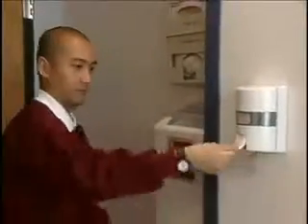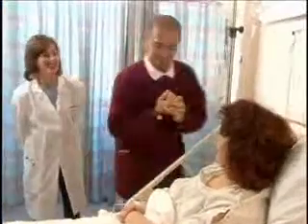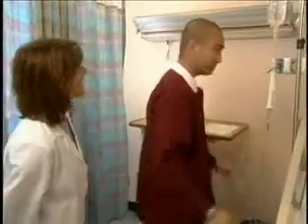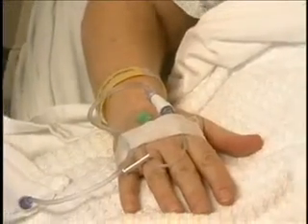So you feeling a bit better? I am doing quite well, really. Good. Glad to hear it. You're in good hands. All right. I'm back. Robert, did you check the compatibility of the antibiotic with the primary IV solution? Oh, yes, I've checked. They're compatible. Okay, thank you. Let me take a look at your IV site. Looks like it's free from infiltration and inflammation.